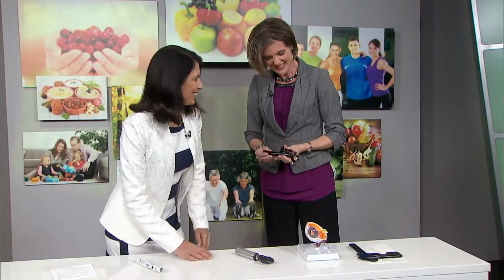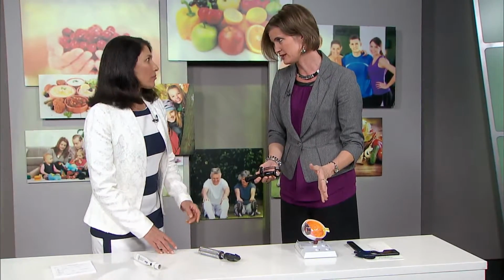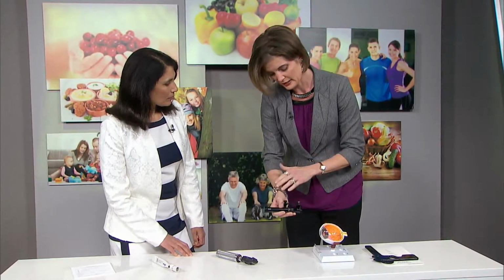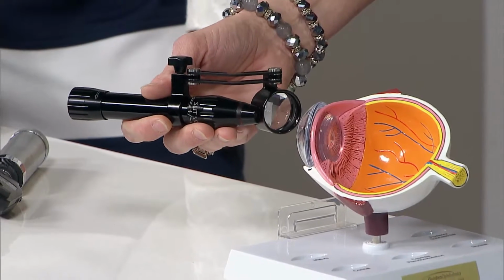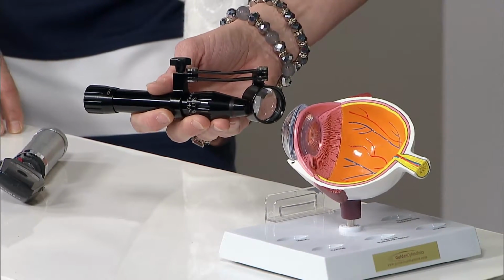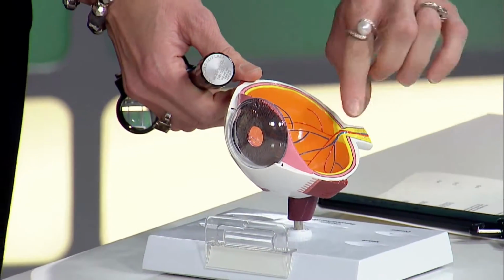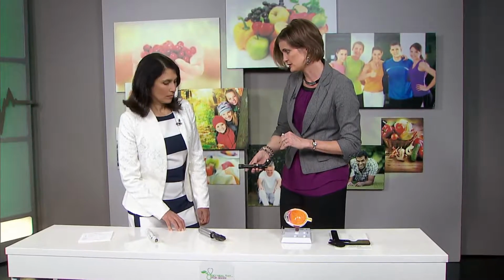But you're right. So then, yeah, after they're dilated like that, which usually will take between 20 and 30 minutes, then I will be able to see all the structures inside the eye. And this is a portable slit lamp that allows me to be able to look at the front part of the eye in detail and determine if there's any cataracts or any abnormalities with the cornea. And then I would switch to a different handheld magnifier that would help me to view then the retina and the macula and the optic nerve inside the eye to check for things like glaucoma or macular degeneration.